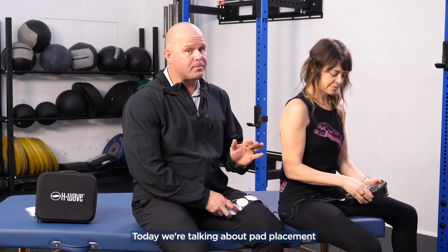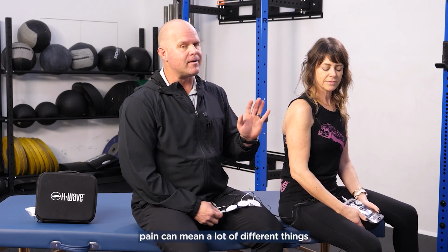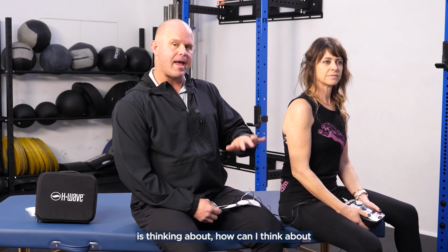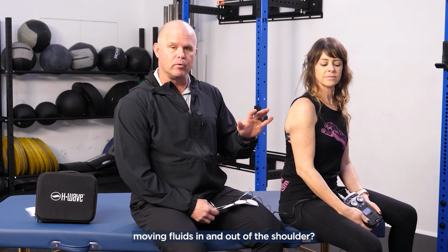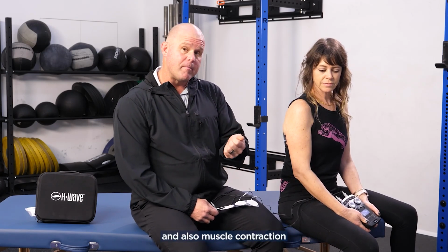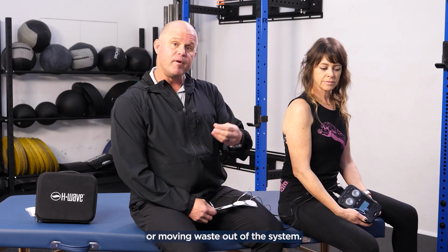Today we're talking about pad placement for shoulder pain. Now look, shoulder pain can mean a lot of different things to a lot of different people, but what we're really after is thinking about how I can move fluids in and out of the shoulder. So the muscle contraction is going to drive blood flow. We know that's going to happen. And also muscle contraction is ultimately going to work on decongesting or moving waste out of the system.